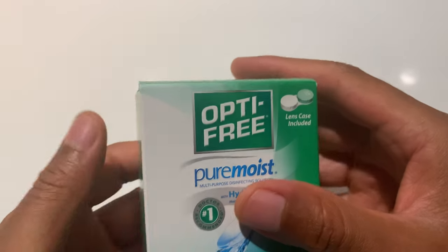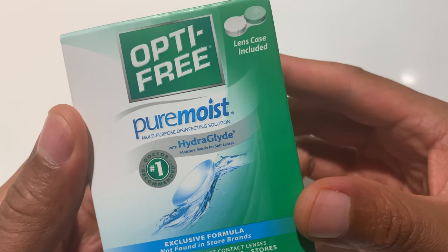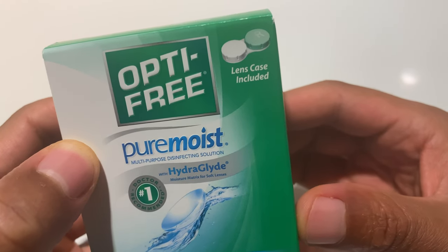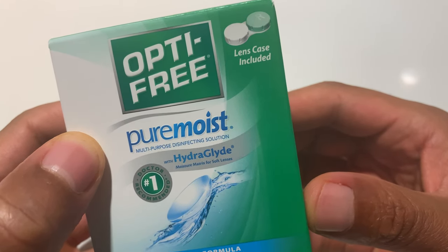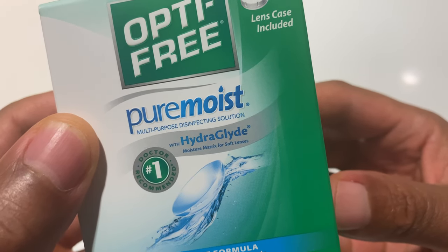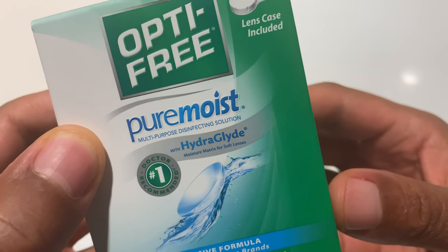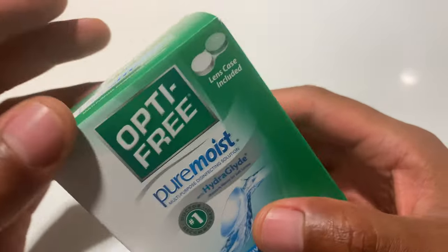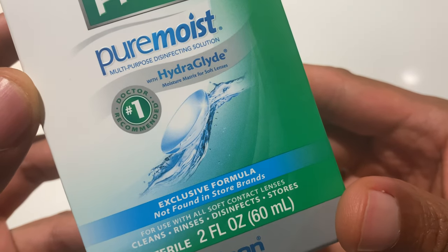This is the Optifree PureMoist HydroGlide contact lens case included, as well as the multi-purpose disinfectant solution with HydroGlide. Moisture matrix for soft lenses right here. Exclusive formula not found in store brands.